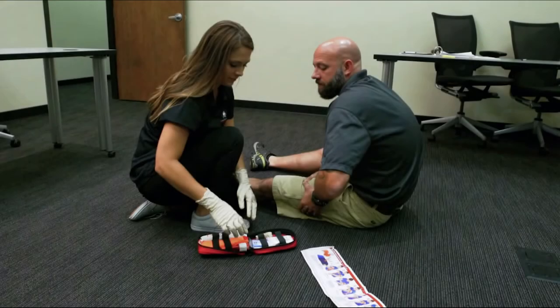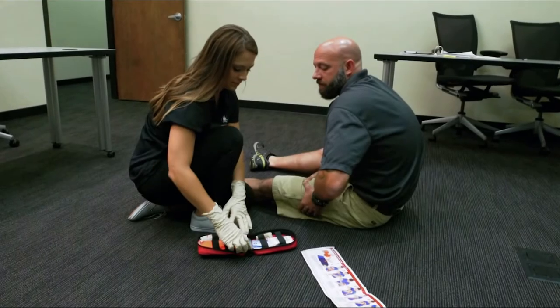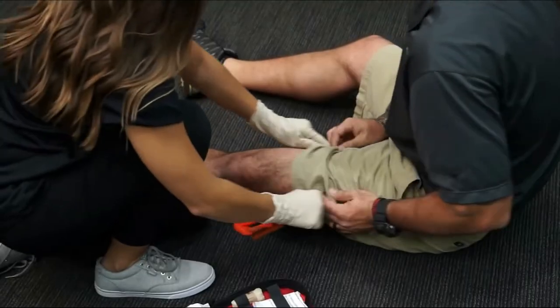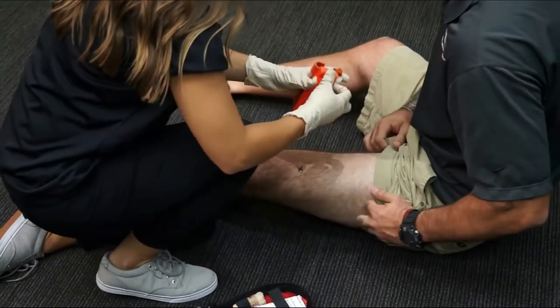Gloves should be worn during the application. To begin, remove the CAT from the bleeding control kit. For best results, expose the skin where the wound is located.